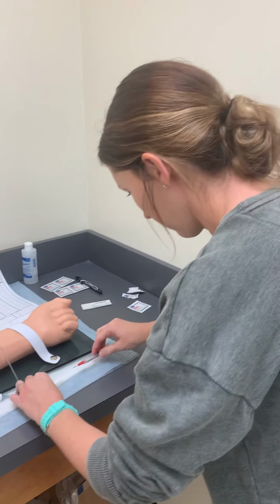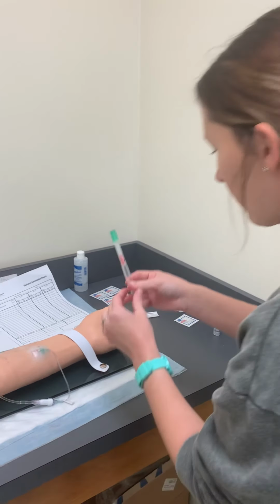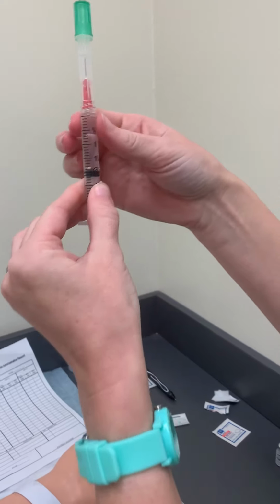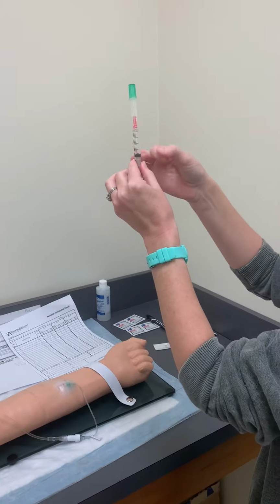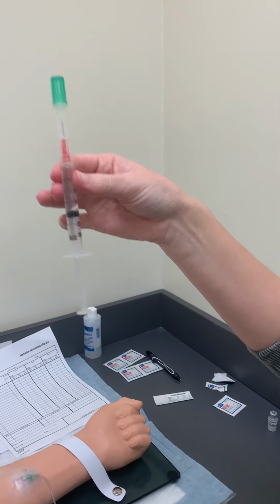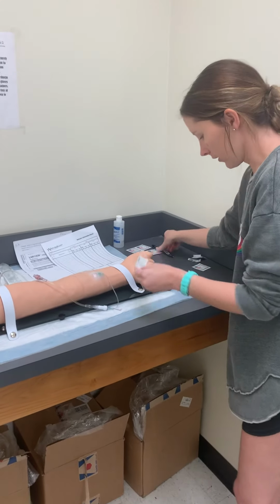Just scoop my cover back on and check for any air bubbles. That's one tiny little air bubble. Got it. Right, then I have 2 mLs of my medication. I have an air bubble over here. 2 mLs of medication.